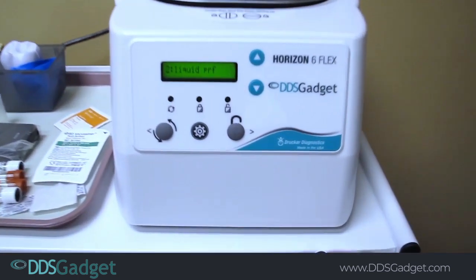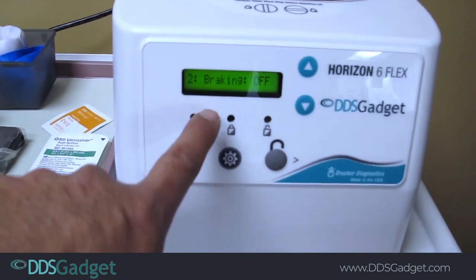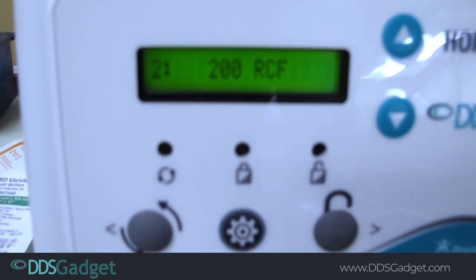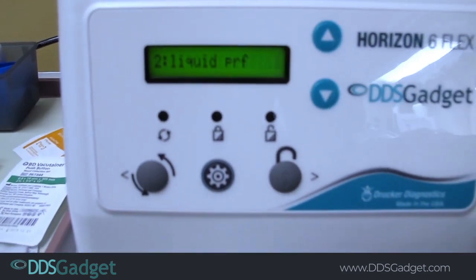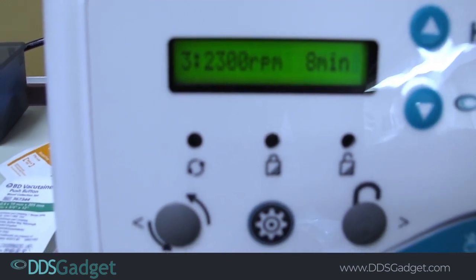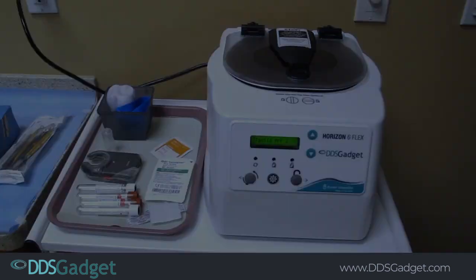Here's a little video of the horizontal centrifuge — it holds six tubes. We're going to be doing a liquid PRF at 1200 rpm for eight minutes. We can also do regular PRF in this machine's program in setting number three, which is solid PRF, and we're going to spin it at 2300 rpm for eight minutes and we should get really nice clots.